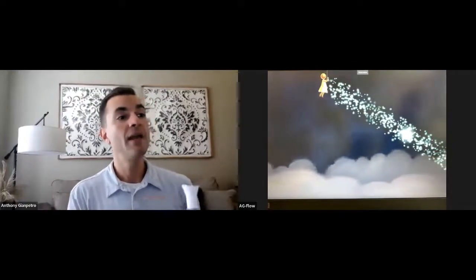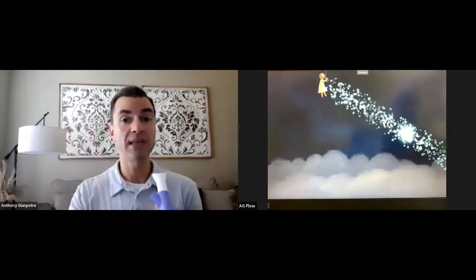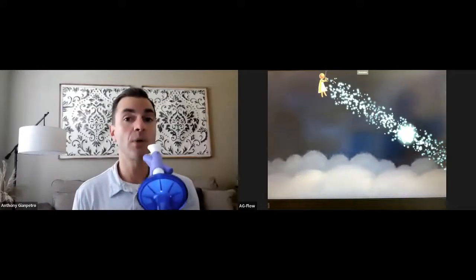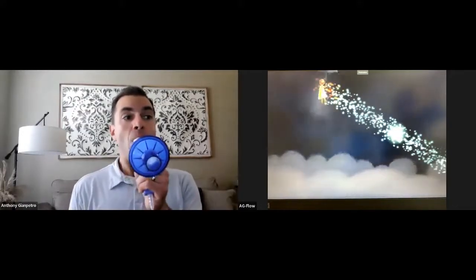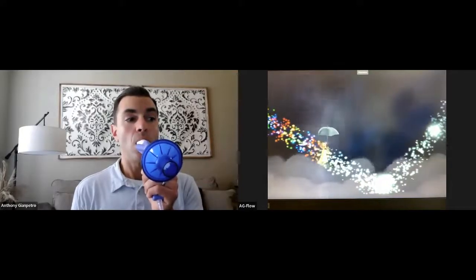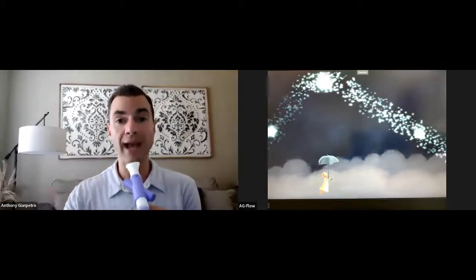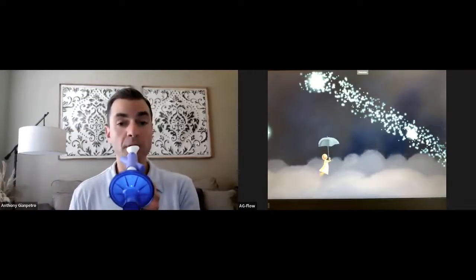Okay, and so there's the patient as an avatar with an umbrella. Let me move this back a little bit more. And now again, the objective is to breathe and stay within that starry road path. And it's set where an exhale lets the avatar go down and then go up. So this is what it would look like. And you'll notice that was about 6 seconds, which is what I set the device to for breathing out. I missed the inhale a little bit, so I'm going to start that and start the exhale again.